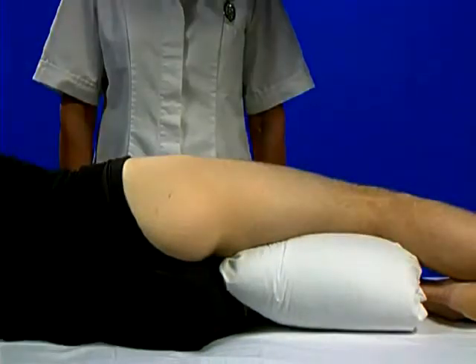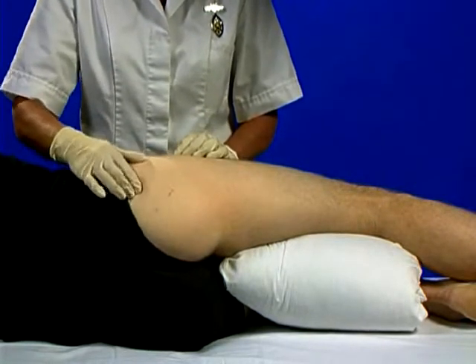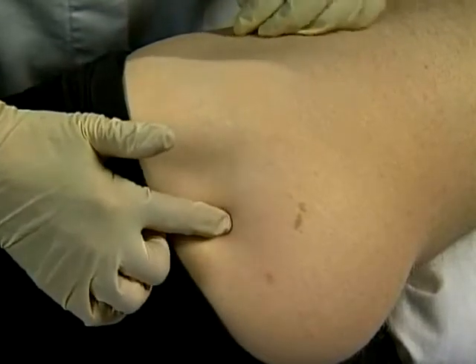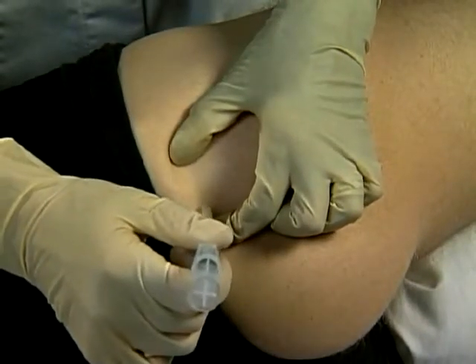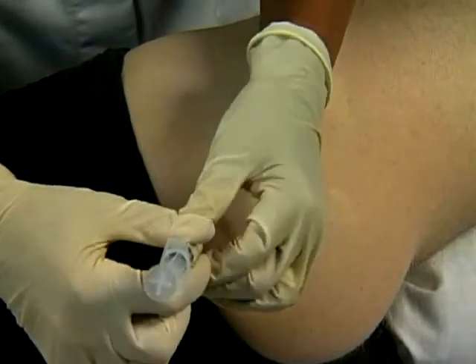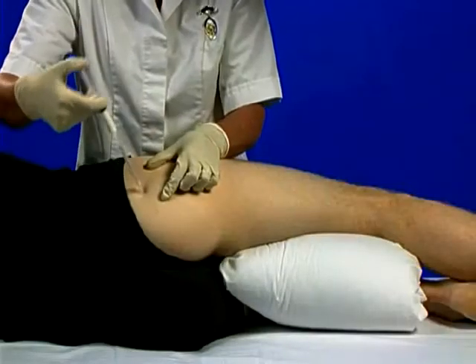The patient is in side lying with upper leg flexed and lower leg extended. Palpate the tender area and mark epicenter. Clean and firmly stretch skin and rapidly insert a 3 to 4 inch spinal needle perpendicularly. Pass slowly down to gently touch blade of ilium. Aspirate and deliver injection in several boli, moving needle towards the surface as if walking up a spiral staircase.